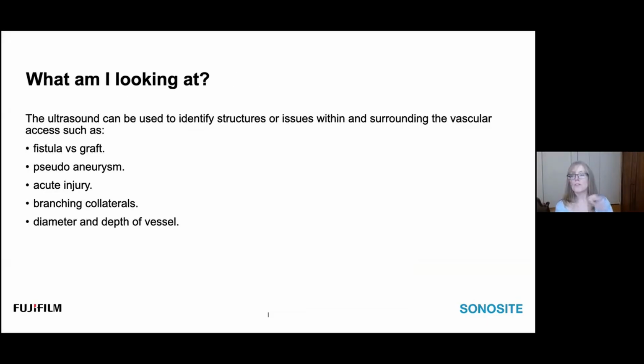All right, so those are the basics of how to use ultrasound for guided cannulation. Trust me, it can be very frustrating. I would not recommend that you start using it on somebody who has a complex access. If you have the luxury of cannulating a patient that you have not missed on before, or that you very rarely miss on and they have a nice big access, that's who you need to start your practice on. The for-sures, the patients who don't make you sweat when you see them because you can cannulate with your eyes closed. Use the ultrasound with them.